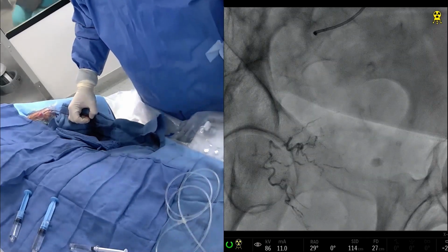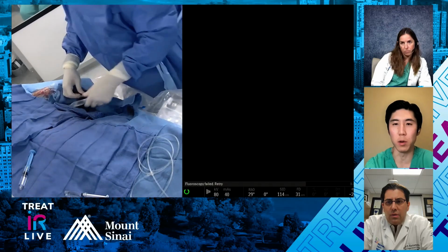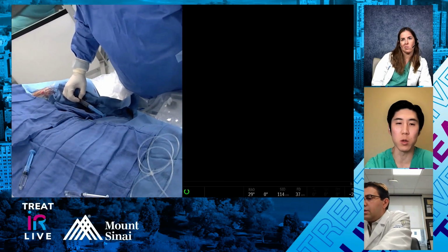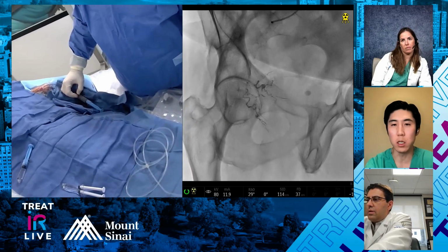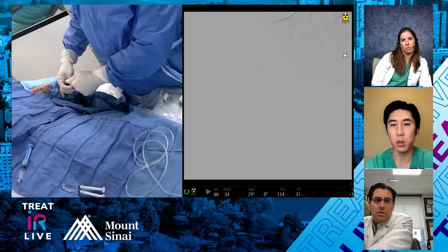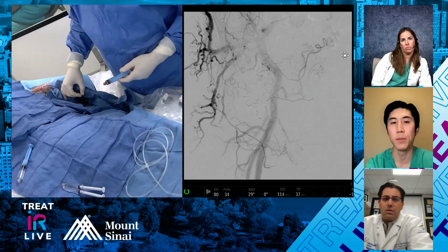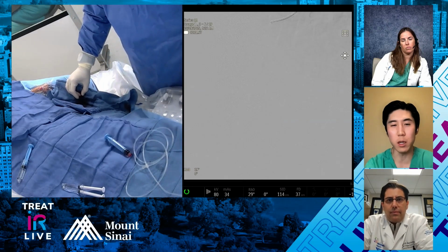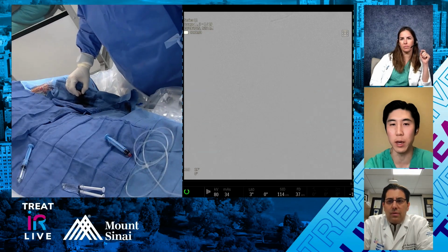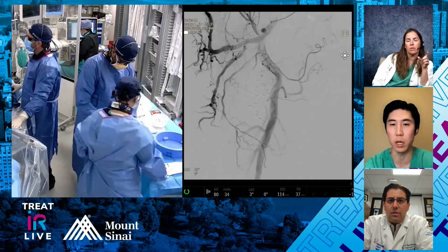Yeah, something I wanted to bring up about that was that sometimes what you can do if you're not using a Sniper, for example, and some places don't have access to a Sniper catheter, is you can actually select more distally into the more medial branches and use your flow to inject the glue into that central portion. And then as you're gluing that out, you can kind of pull back and you can get a pretty deep penetration. You don't necessarily need to have the Sniper catheter to do that, for people who want to get the deeper penetration and don't have access to one.